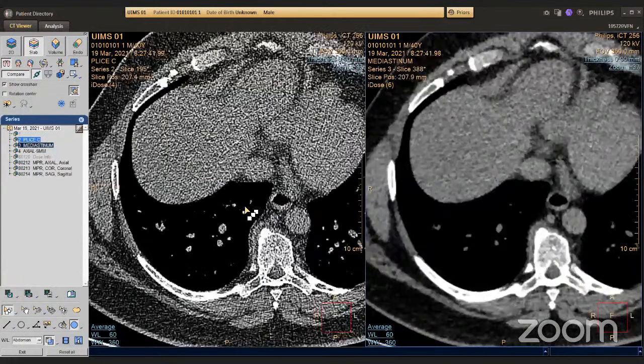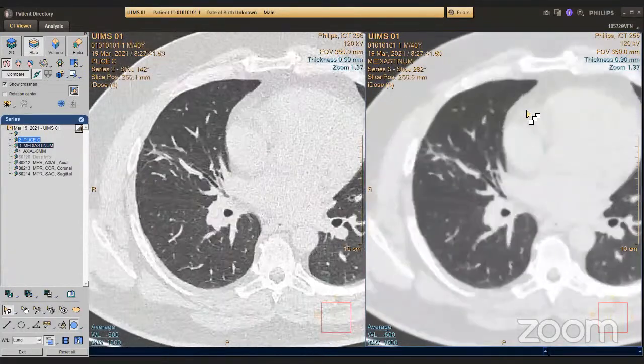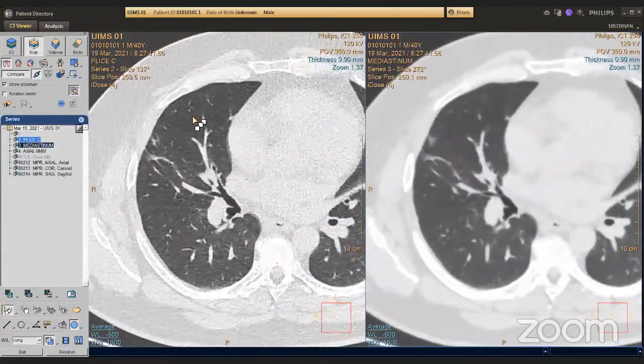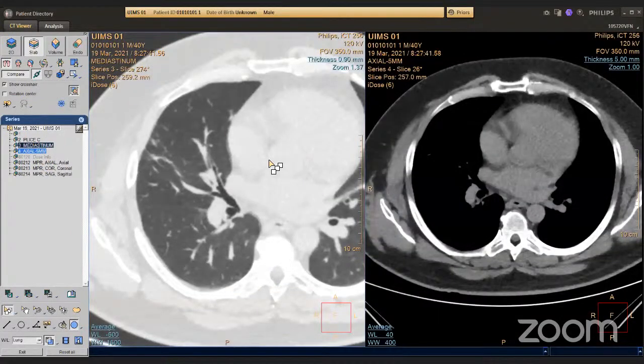Not all investigations have this sharp imaging. You always have the soft one; you sometimes don't have the sharp one. You can see the lungs in the sharp one and in the soft one also. You just can't say much about some discrete things in the interstitium and so on. So this is the first thing I want to show you. Then the second thing is the slices.